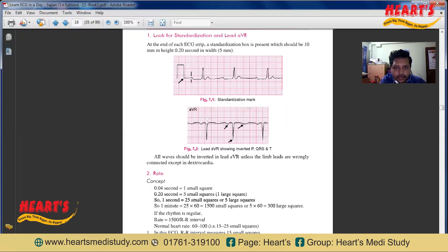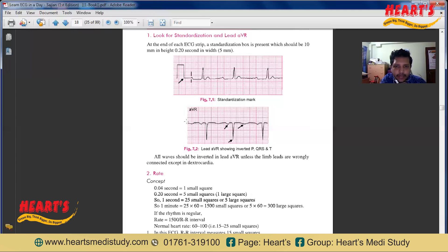The second point is lead AVR. AVR is situated on the right side of the body and the heart is on the left side. So the impulse is going away from AVR, meaning all waves here are negative — P wave is negative, QRS complex is negative, T wave is negative. We should check this first to detect whether there is any dextrocardia or situs inversus. If there is dextrocardia or situs inversus, then the waves in AVR will be positive. But if there is no dextrocardia yet the waves in AVR are positive, we call it wrongly placed leads.